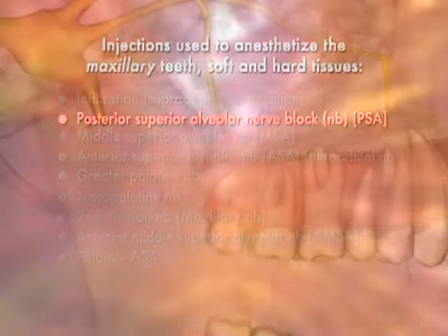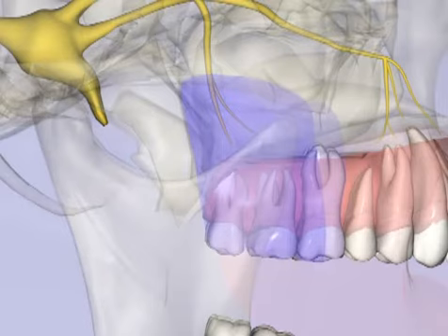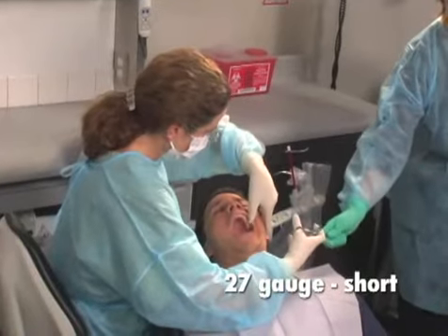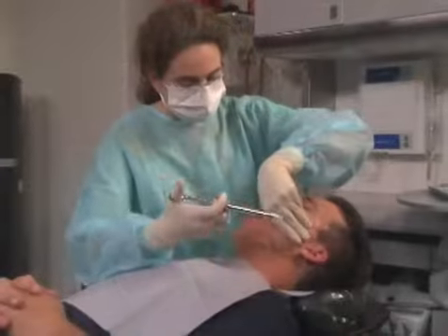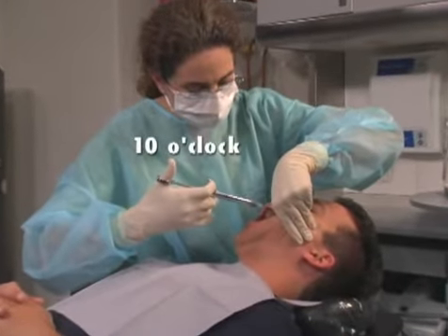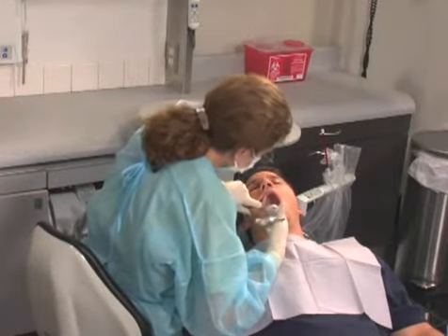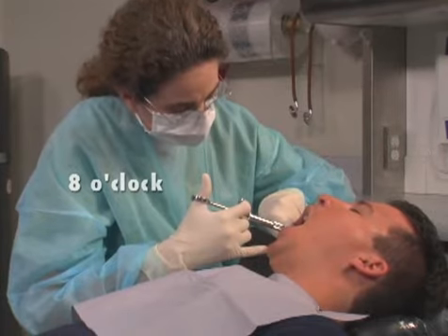The posterior superior alveolar nerve block provides pulpal anesthesia to the 3 maxillary molars and the supporting buccal soft tissue and bone. In 28% of patients, the mesial buccal root of the first molar may not be anesthetized. A 27 gauge short needle is recommended. For the left PSA nerve block, a right-handed operator should sit at the 10 o'clock position facing the patient. For the right PSA nerve block, a right-handed operator should sit at the 8 o'clock position facing the patient.